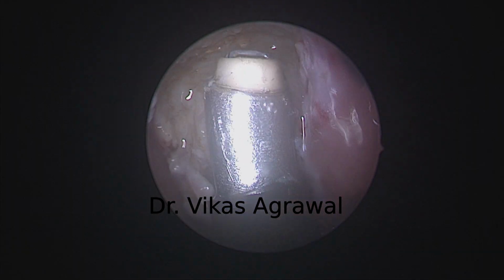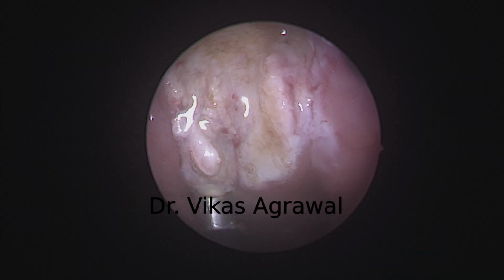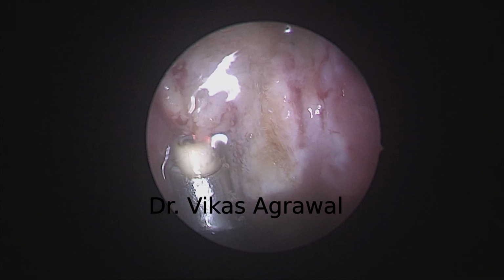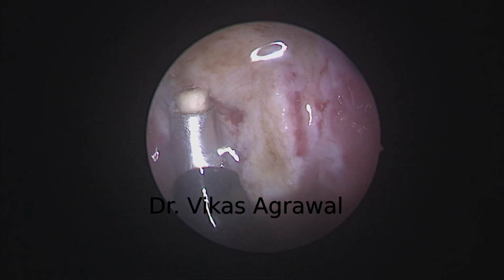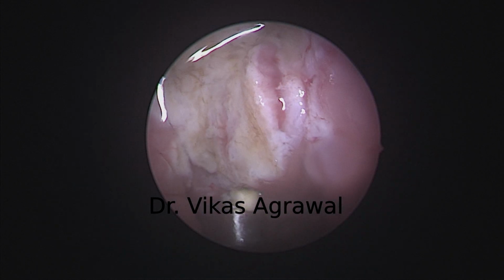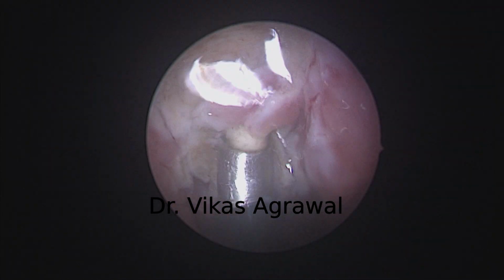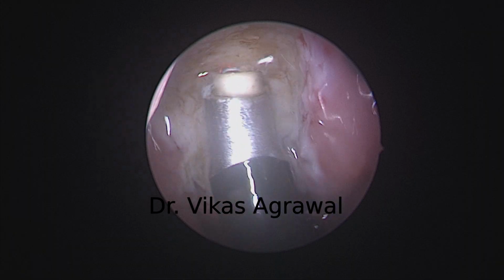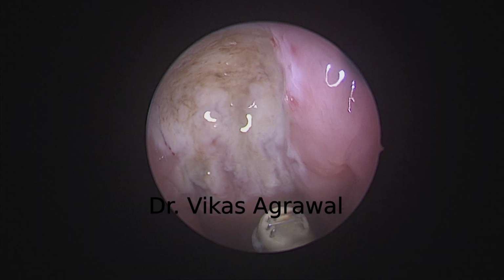You see, this is the periosteum. You are not supposed to open up the periosteum. You are only supposed to reach the periosteum. As we further go inside, we are reaching the posterior boundary, which will be the buccopharyngeal fascia.